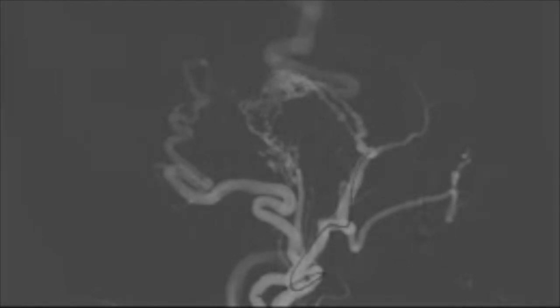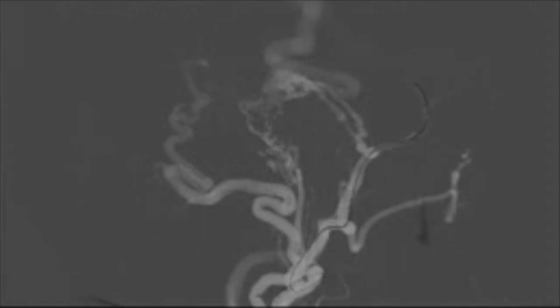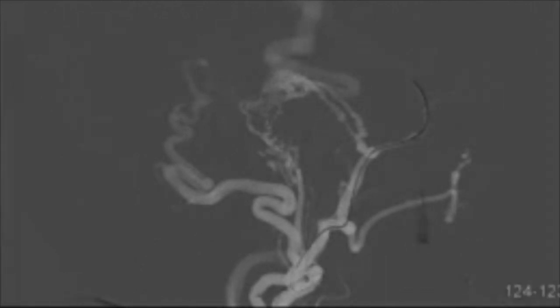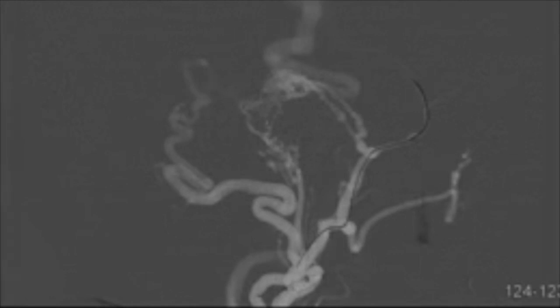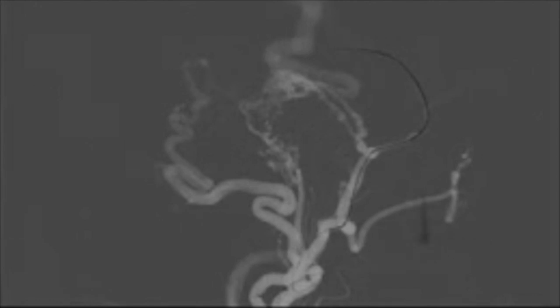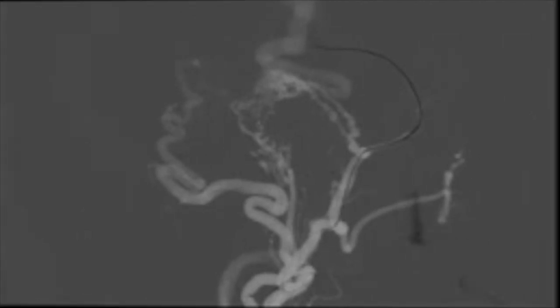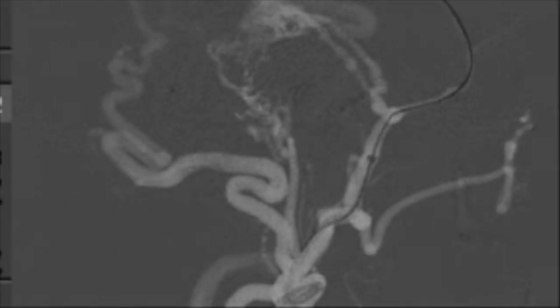First we tried a transarterial approach. The procedure was performed under conscious sedation through a right femoral artery approach. A large guide catheter was placed in the external carotid artery. An intermediate catheter was navigated into the maxillary artery, and the microwire and microcatheter were navigated into the branches of the middle meningeal artery.